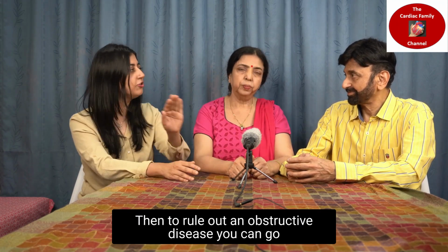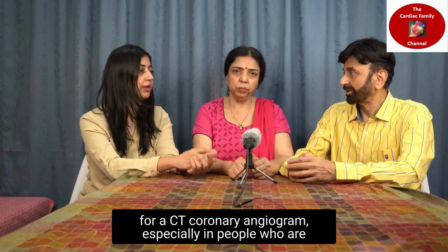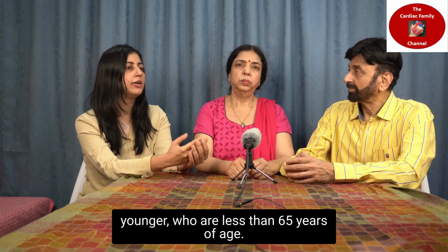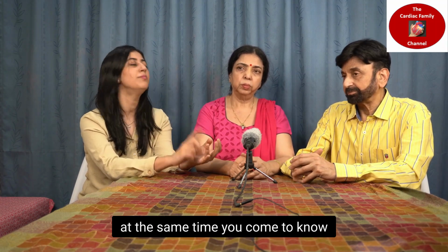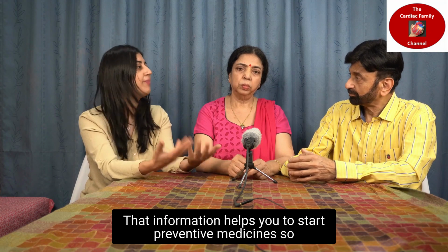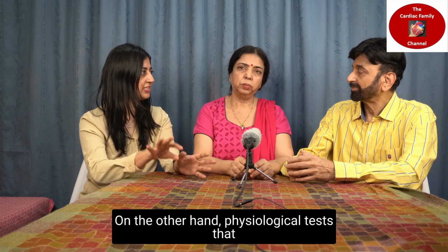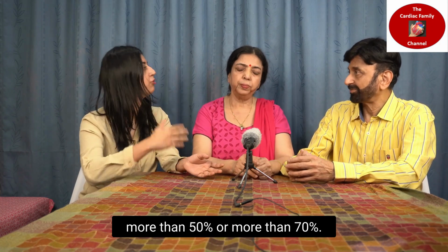then to rule out an obstructive disease, you can go for a CT coronary angiogram, especially in people who are younger, less than 65 years of age. You can rule out an obstructive disease, but at the same time you come to know if there are non-obstructive blockages, and that is also useful. That information helps you to start preventive medicines, so that in the future they don't get obstruction. On the other hand, physiological tests that are stress test based do not detect non-obstructive diseases. They only detect something significant, more than 50% or more than 70%.